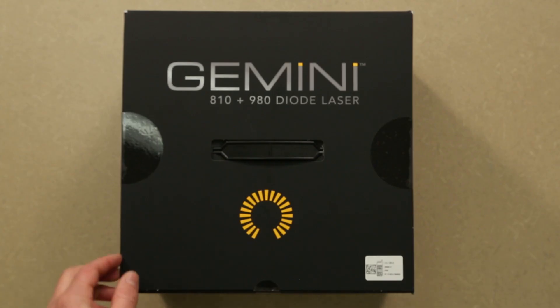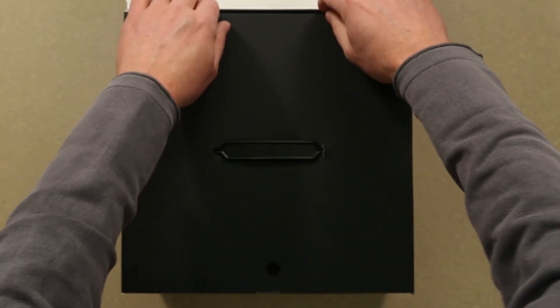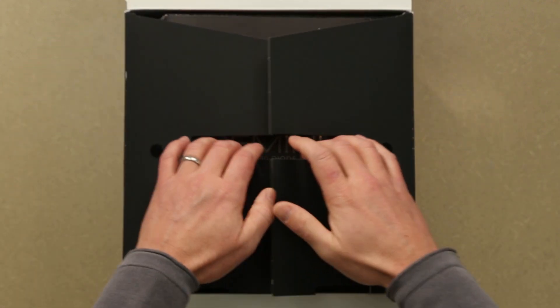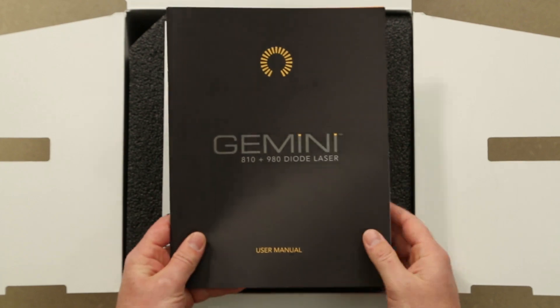The Gemini 810 and 980 Diode Soft Tissue Laser Kit comes with everything you need to get started. Please read thoroughly the Instructions for Use booklet contained in the kit before proceeding.